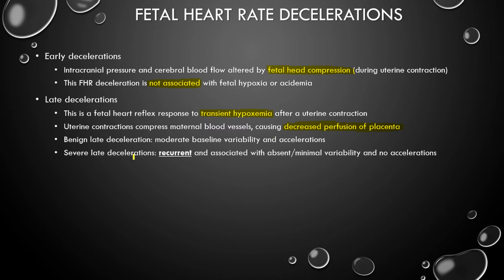But if you have severe late decelerations, that's when they are recurrent and associated with other problems such as absent or minimal variability and a lack of accelerations. So you see this triad of recurrent late decelerations, variability loss, and no accelerations. You should be very concerned about hypoxia and acidosis. And a recurrent late deceleration by itself is also very bad and is a sign of a major problem.